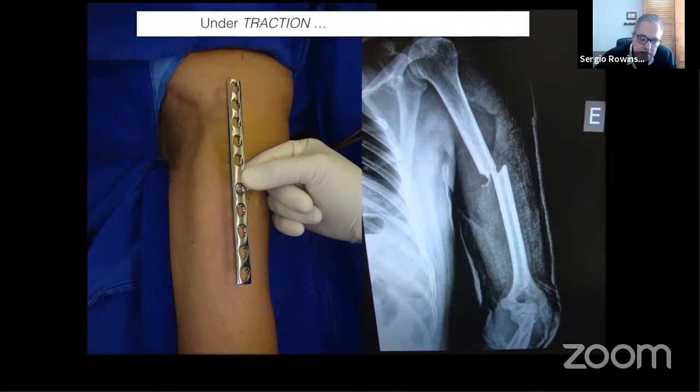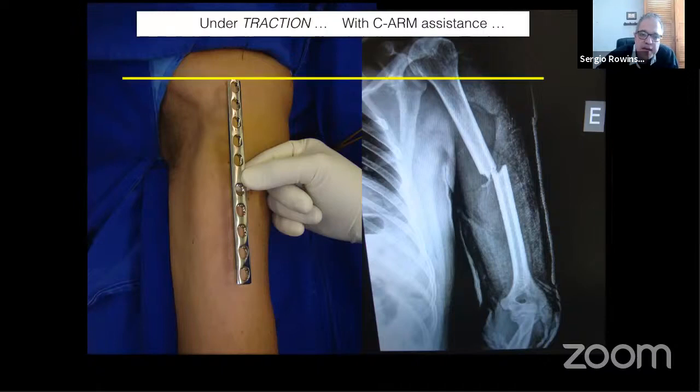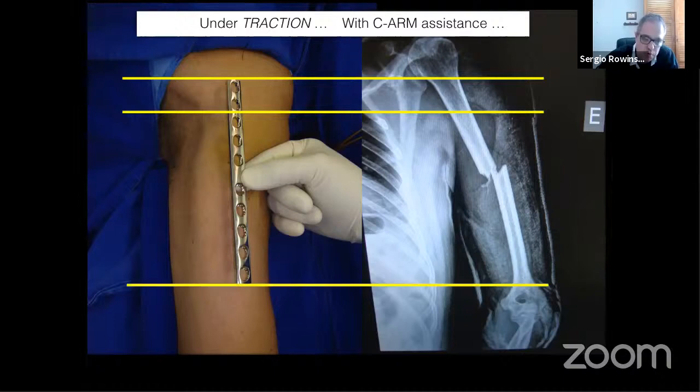Always under C-arm guidance and traction. I'm going to draw my incision between the 2 most distal screws, proximally and distally. I'm going to draw my incisions with a marking pen, and my distal incision is different, which I'm going to show in a minute.